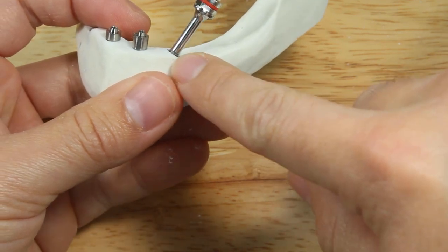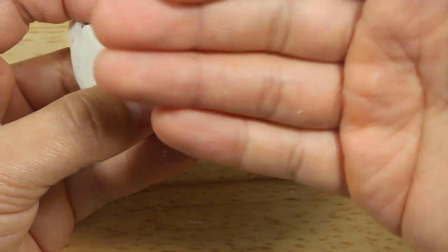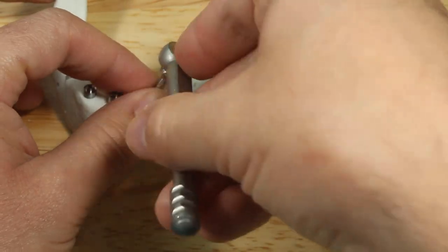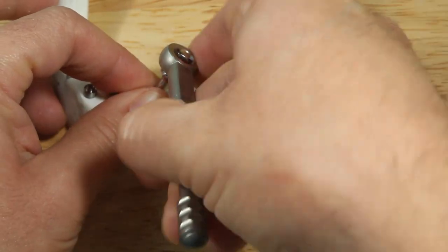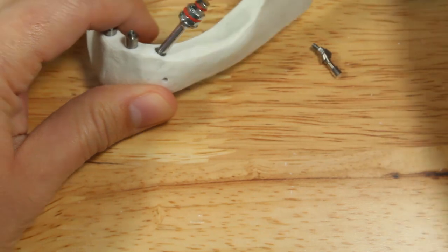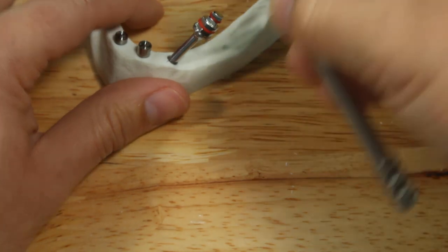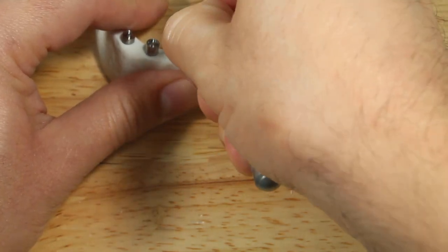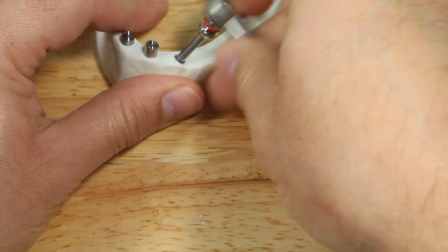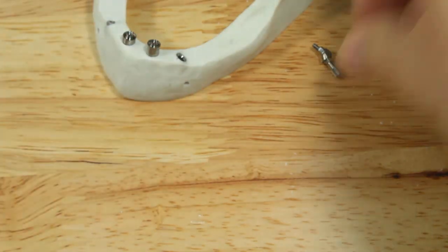Basically, you want that hex on the plane you're trying to correct the angle on. Right now it's on the buccal, but I'm going to twist it just a little bit to change up that plane slightly. Now it's going to bring the angle that way. I play with this until I'm confident it's going to bring my angle to where I want it.